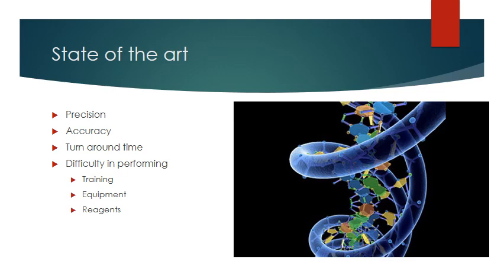One of the problems, though, with molecular techniques really is the difficulty in performing. The training, the equipment, and the reagents all are impediments, really, to implementing molecular techniques. Now, while younger technologists would have more exposure to these molecular techniques during their training, us old folks, we didn't get a lot of this because it wasn't available at the educational level when we were being trained.